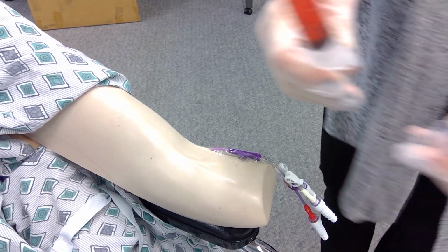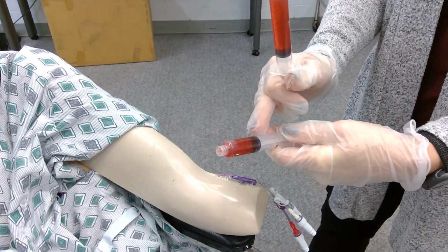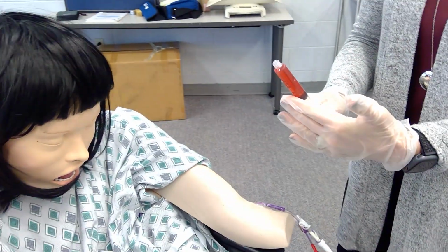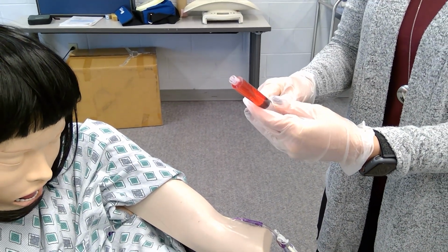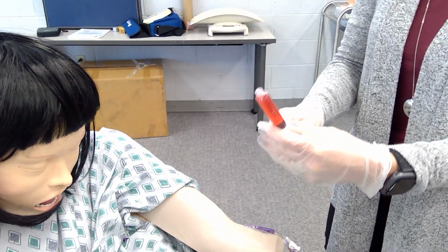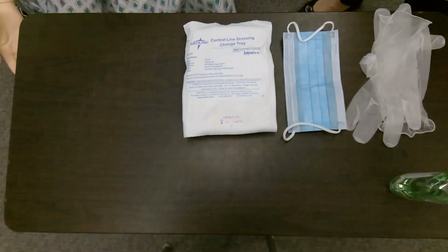Now from the 2 that you drew, the 5 ml is going to be put in the waste. The 10 ml is going to be put into the designated vials, tubes, to be sent down to the laboratory to be analyzed. And that concludes the blood draw.